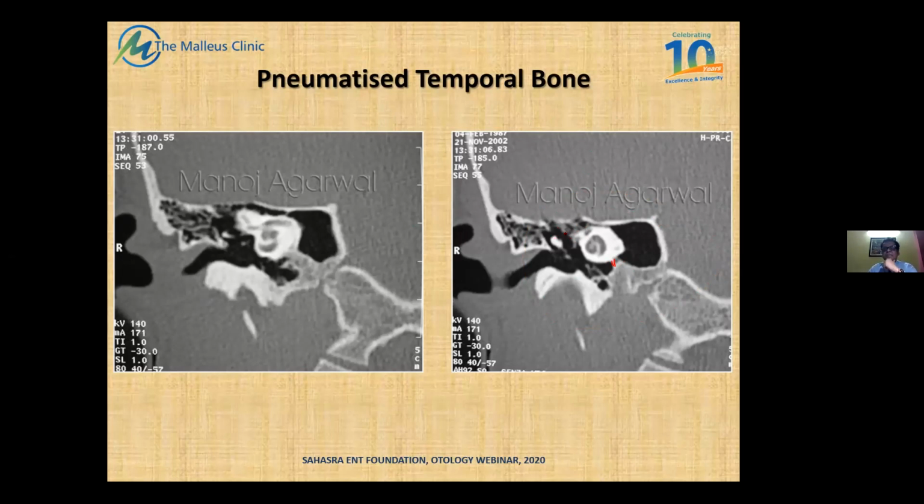But obviously, it is not the periantral air cells because we are much more anterior, because we can see the head and the body. We remember the bilobed structure. So this is the incudomalleolar joint. This is neither the incus alone nor the stapes nor the malleus alone. It's a bilobed structure, so it's the incudomalleolar joint. This is the handle of the malleus. And can you see the snake eye appearance here?